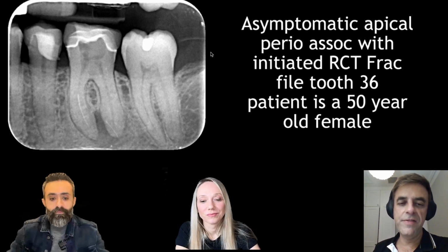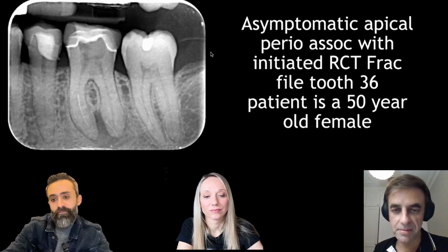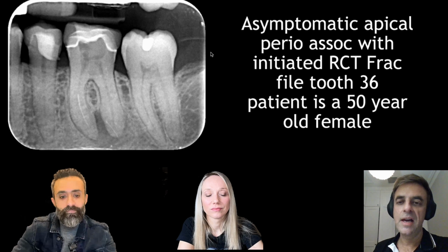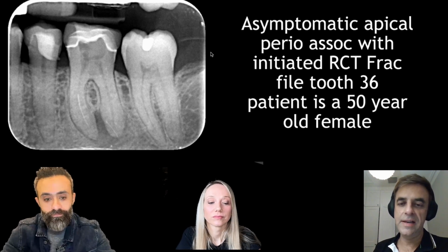Yeah, this is a very, very interesting one. This patient came to me. They had root canal treatment started by their general dentist. During that procedure, the file was fractured, and the patient's again 50 years old, so many years to chew on this tooth.